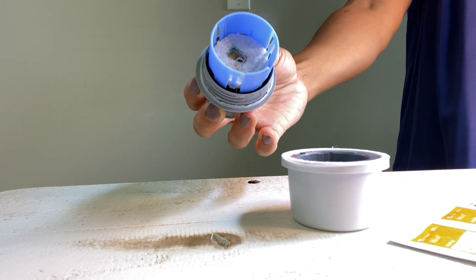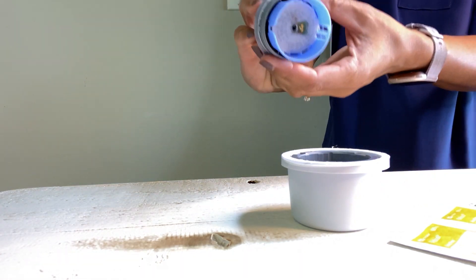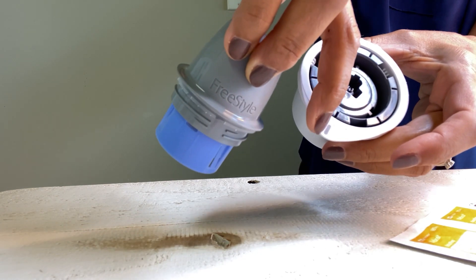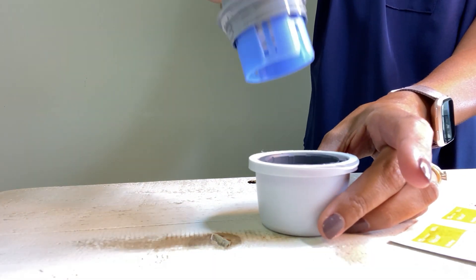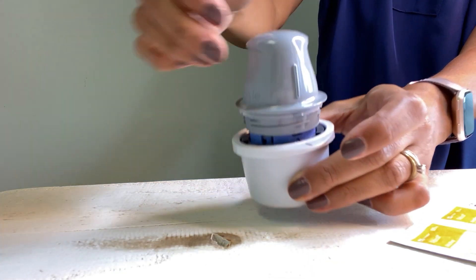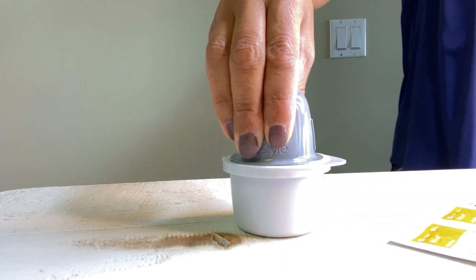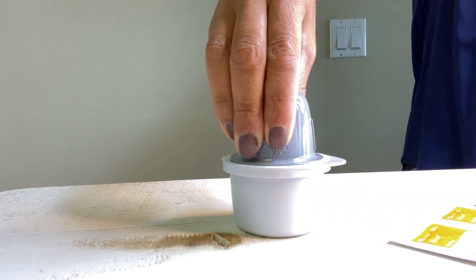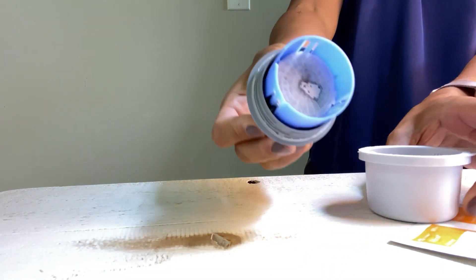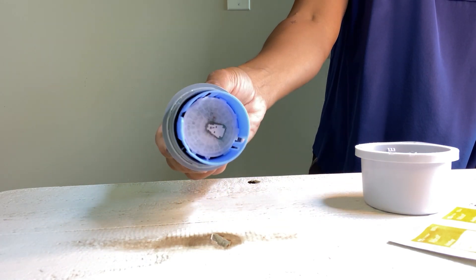You want to line up the marks on the sensor and applicator and have it on a hard surface. There's a mark here and a mark there — align those, then press down. Then simply lift the applicator out of the sensor pack. You can actually see the needle now — it's in there. We're ready to apply it to the arm.